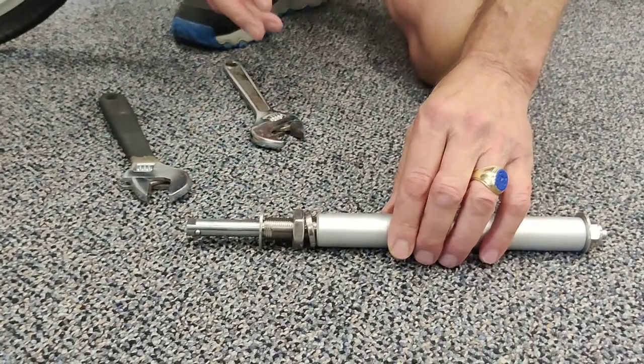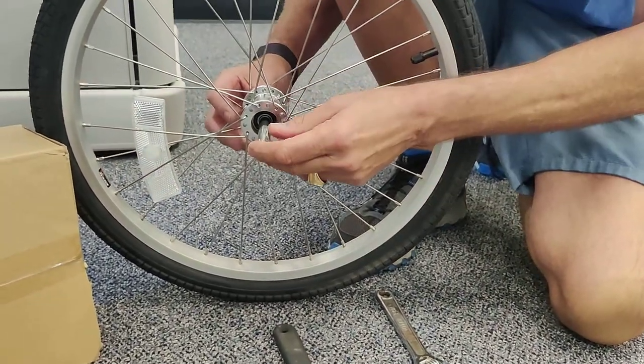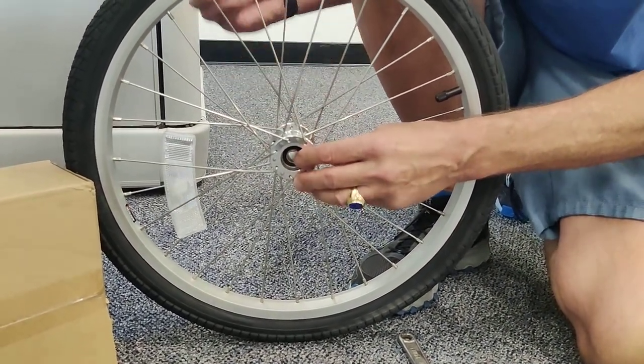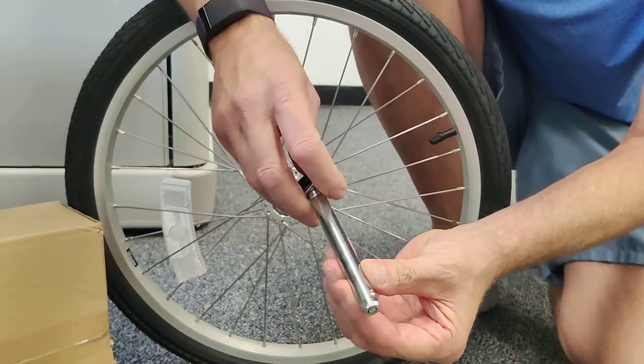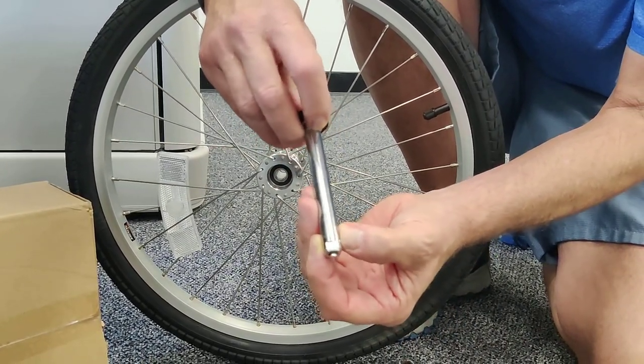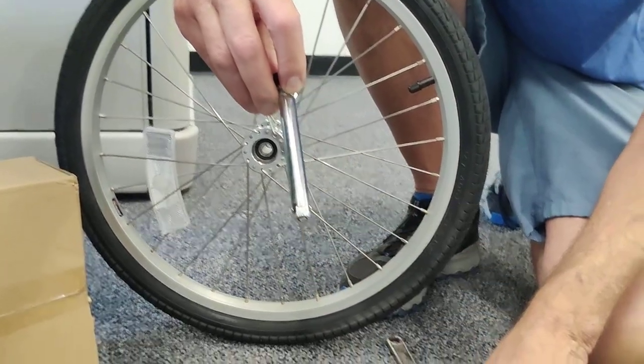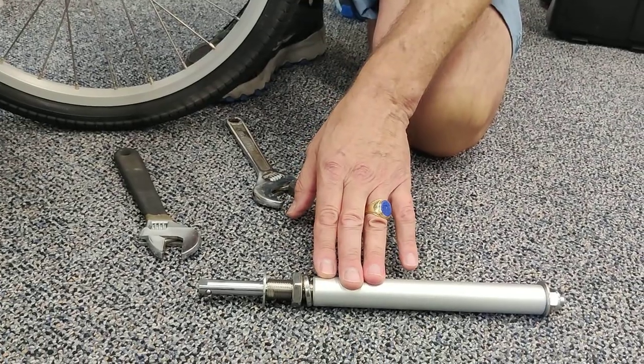What we've developed is a quick release axle system that will take the place of your stock quick release wheel pins. If your wheel pins don't look like this one — in other words a quick release push-button ball locking pin — then this system is not going to be applicable for you.